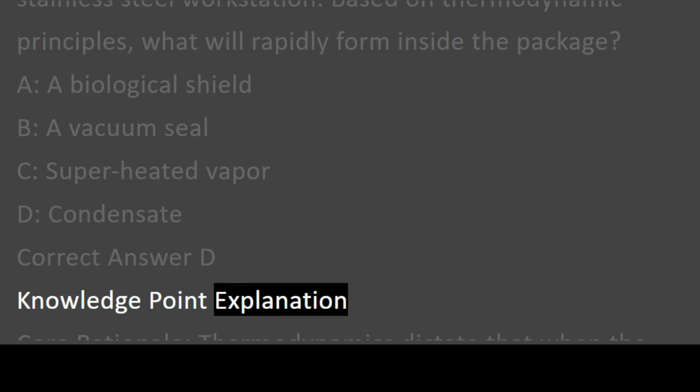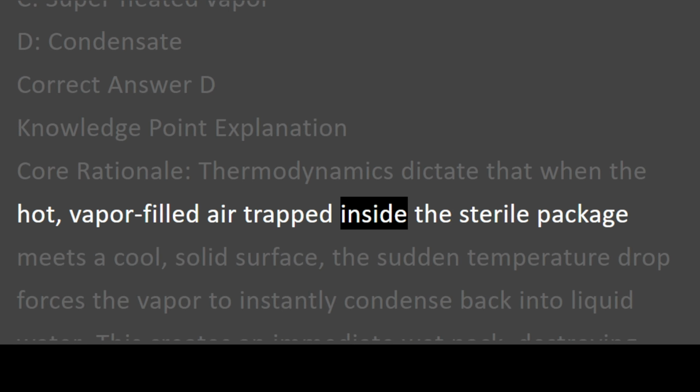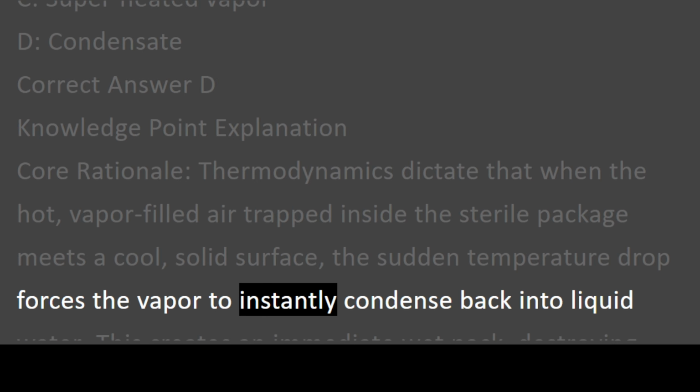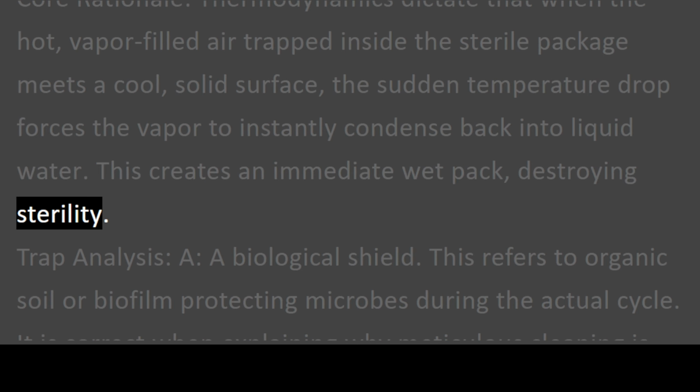Knowledge point explanation. Core rationale. Thermodynamics dictate that when the hot, vapor-filled air trapped inside the sterile package meets a cool, solid surface, the sudden temperature drop forces the vapor to instantly condense back into liquid water. This creates an immediate wet pack, destroying sterility.